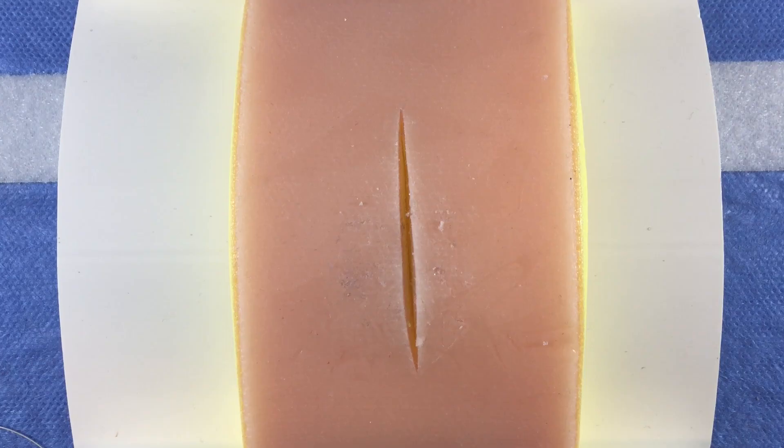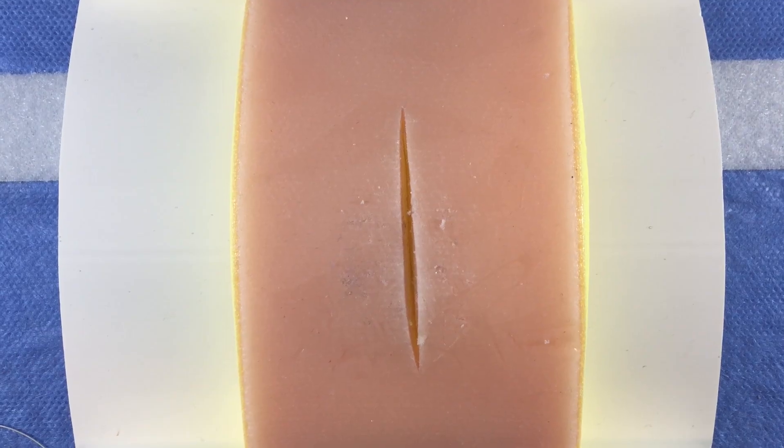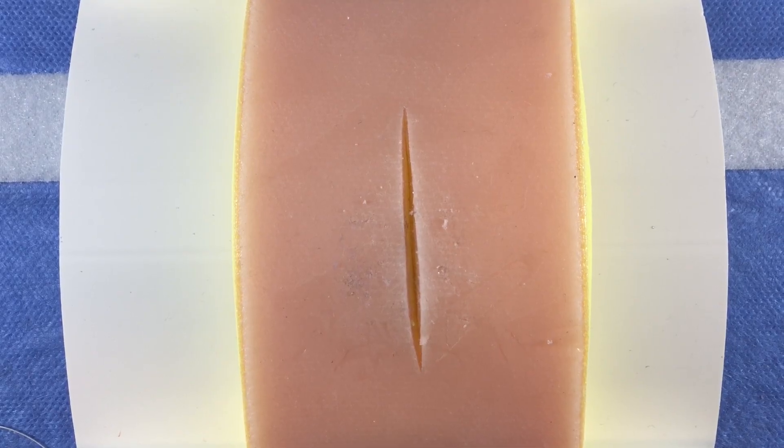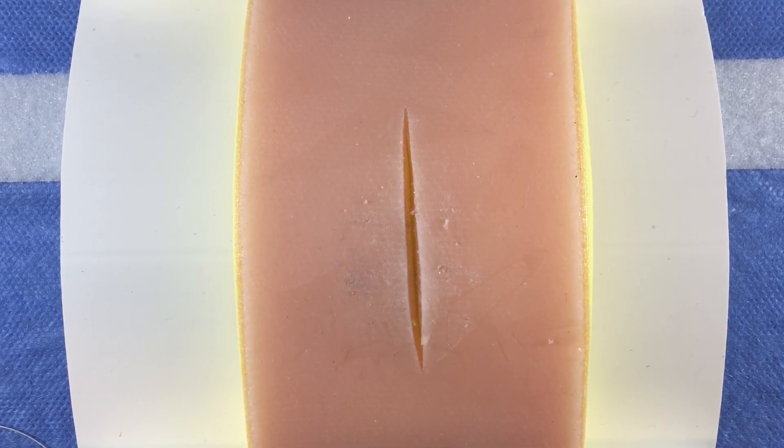Deep dermal sutures are often used to re-approximate the dermis before closing the superficial skin. They provide greater strength to the closure and take tension off the subcuticular layer. Absorbable braided suture, such as undyed 3-0 Vicryl, is commonly used for this step.